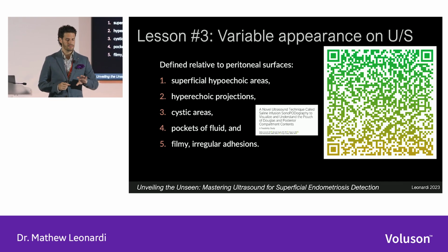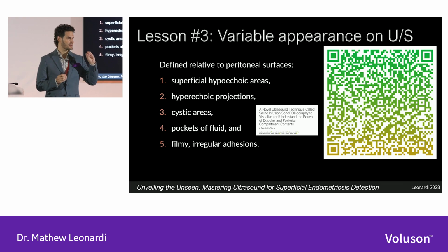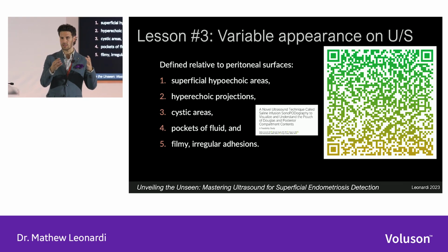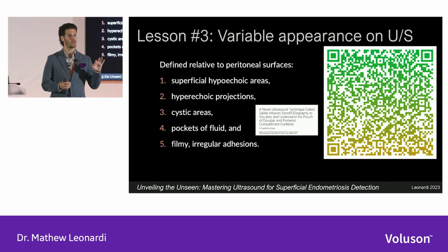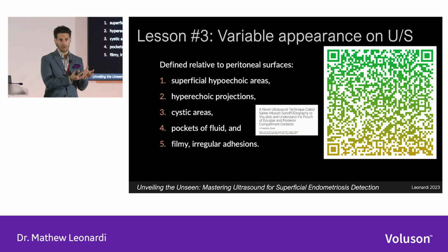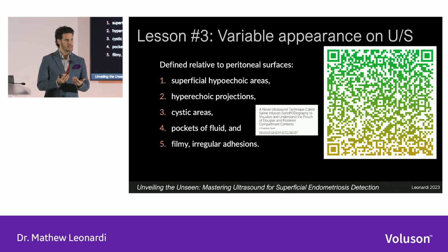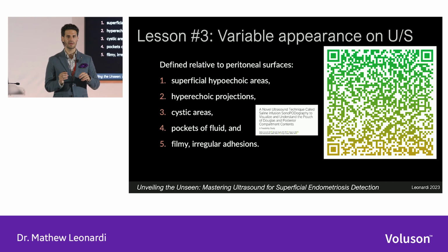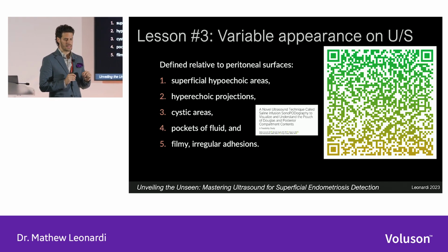Peritoneal pockets are actually quite common in endometriosis. Endometriosis is an inflammatory disease. It settles onto the peritoneum. It releases cytokines, inflammation markers, and holes in the peritoneum can form, which then re-epithelialize. Those holes become chambers that fluid can fill. And on ultrasound, if you release some pressure, you can see fluid fill these spaces, and they look like a cystic space with an incomplete septation, connecting them to the main pouch of Douglas.